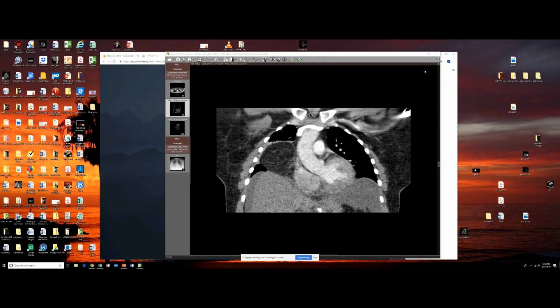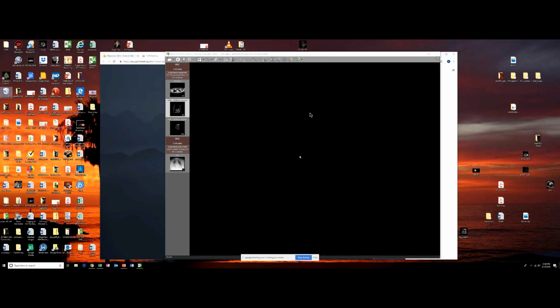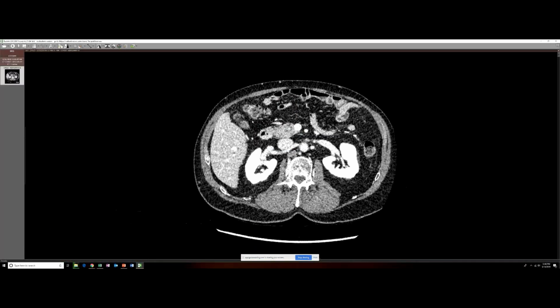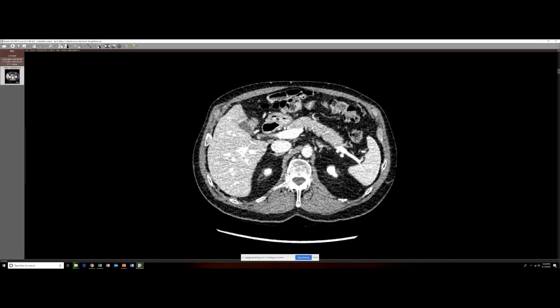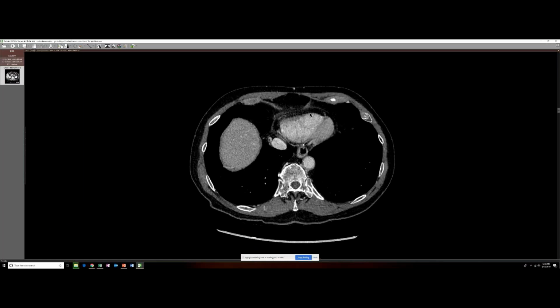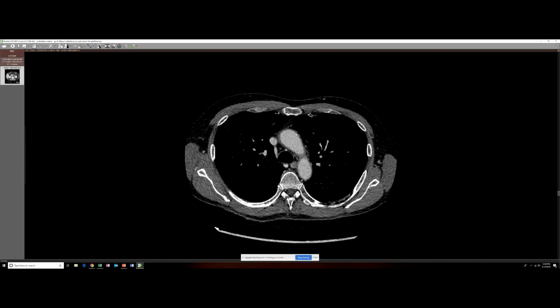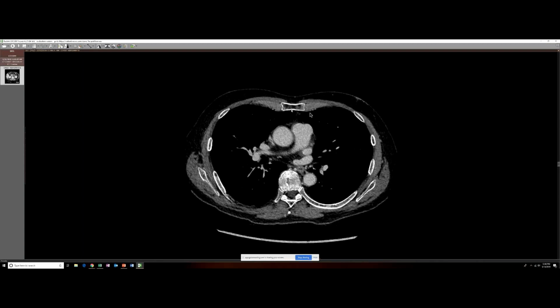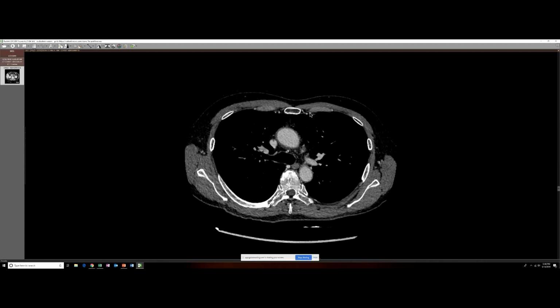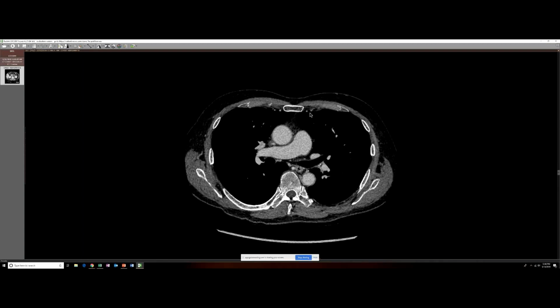This is, if I can get this to pull open. Was a guy who had a really successful therapy, and he had cancer. But anyway, he had SVC syndrome, and he underwent an interventional procedure.